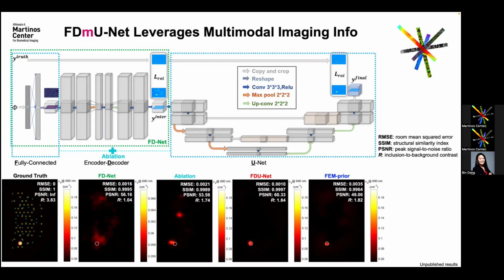The way we incorporate the structural prior is here. After the autoencoder, we use a grayscale DBT image as an additional channel in the UNet. A multi-channel UNet is not something we propose; it's not new. It has been previously used by others to increase the image quality of low dose PET using MR guidance.